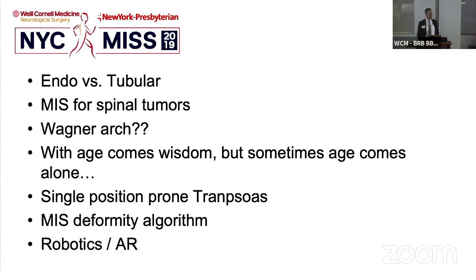And we developed this to get rid of that gap, that learning curve, to not make that human error, so you can trust the computer navigation. So I think that's a big thing. And then one of the other data that we're going to look at and talk about tomorrow is precision, right? Not just accuracy. So are the screws ending up where you think they ended up? Because clinically accurate is different from precision. So we're going to look at, did our phantom screw actually end up where the post-op CT says it is?